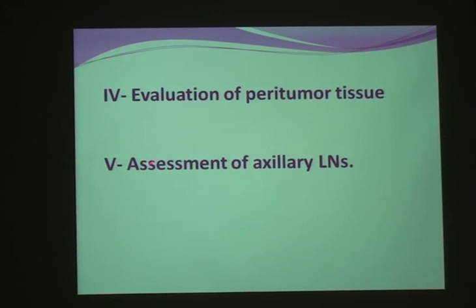Also, the assessment of axillary lymph nodes, which is very important for staging. I wouldn't depend only on the ultrasound or the sentinel mapping, so we can use MRI also. In all this, MRI is a very good and very sensitive, non-invasive technique to detect or suspect malignancy. We don't need as many biopsies as are done these days. It doesn't compromise the patient's life or shape, even cosmetically. It also makes detection of lesions later difficult, as MRI after biopsy should be delayed for 6 months. Why don't we start with the MRI to detect as much as we can?